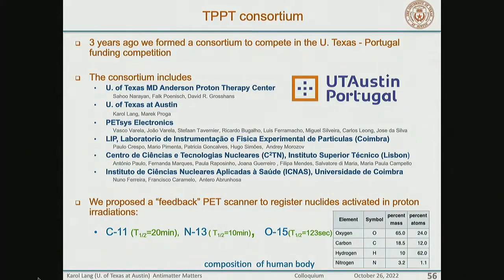The theme for the application was medical imaging, and it was a competitive submission, and we were lucky to team up with 3 institutions from Portugal, 1 company from Portugal, MD Anderson, and our group. So 6 institutions. And we proposed a feedback PET scanner to register nuclides activated in proton irradiations.